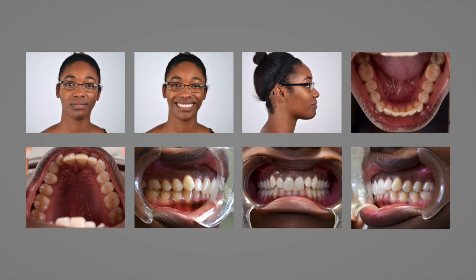Full face photographs should be taken straight on, with the patient's face filling as much of the frame as possible. For the first facial photograph, the patient should assume a relaxed expression while keeping their jaw in occlusion.